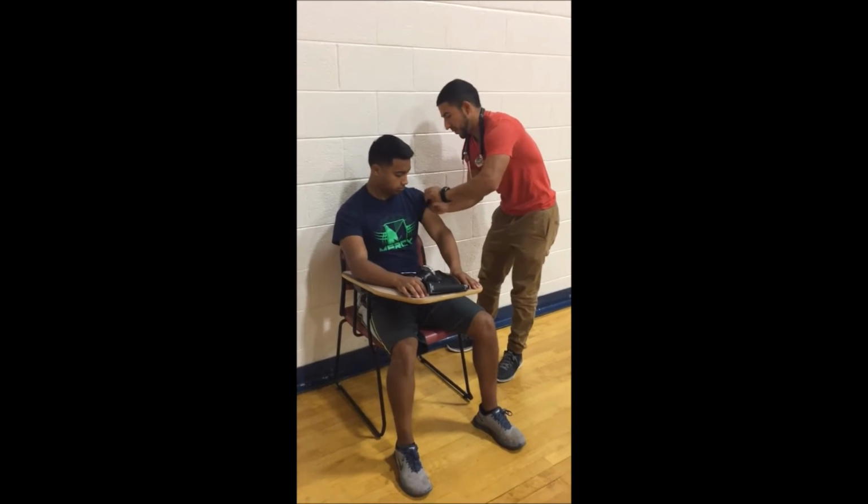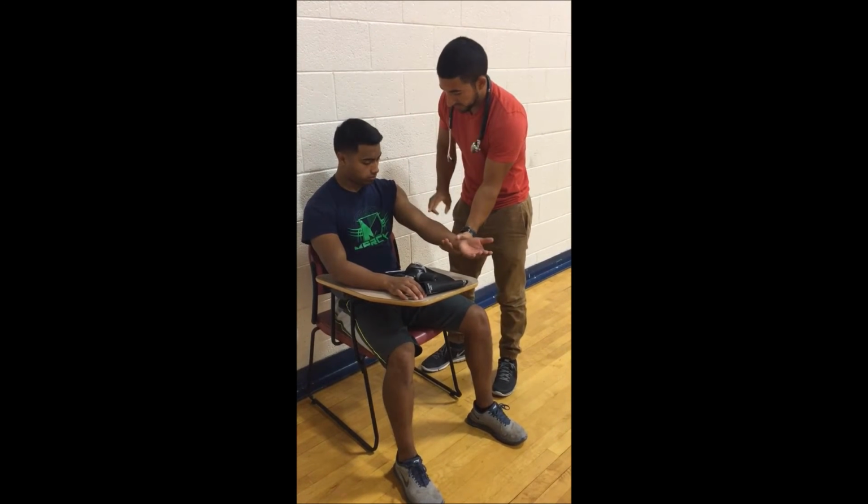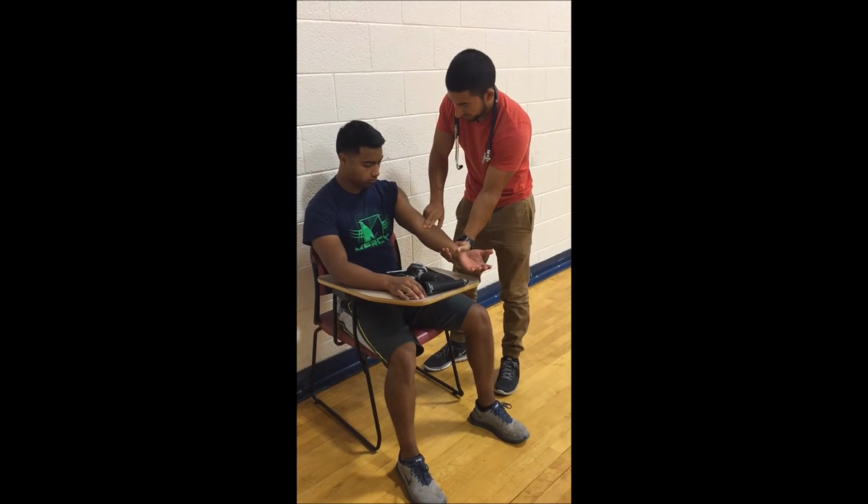Measurements should be taken on your bare arm. Locate the patient's pulse at the brachial artery.